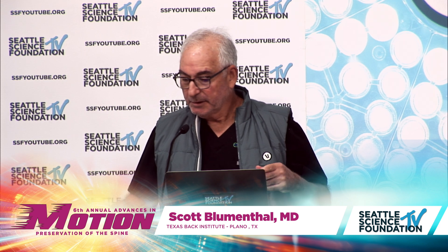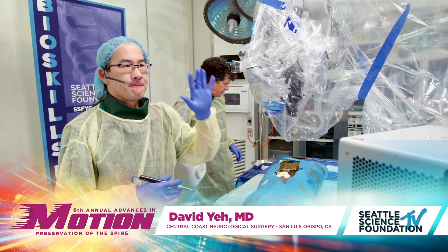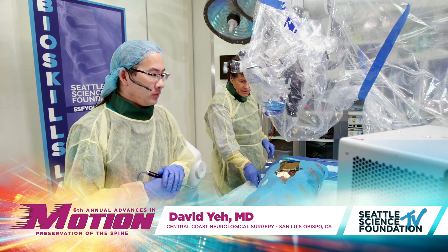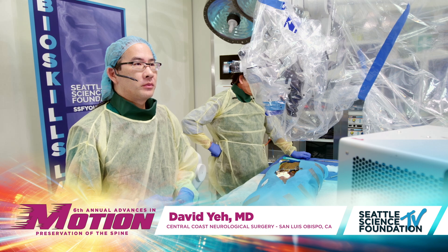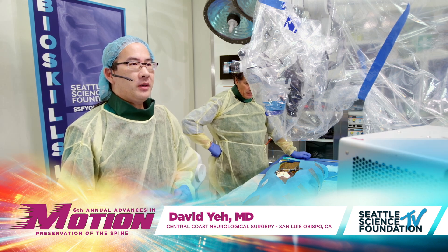We're going to head to the lab now and Dr. Yeh is going to be demonstrating CoFlex. I'm going to give you the mic so that you can explain what you're doing and then you can direct going from the specimen to the C-arm, and we'll moderate any questions that come from the audience.